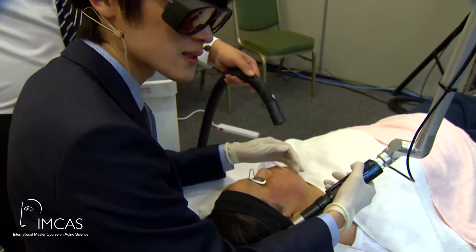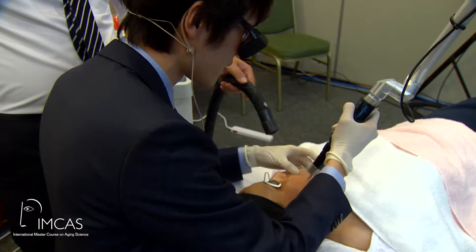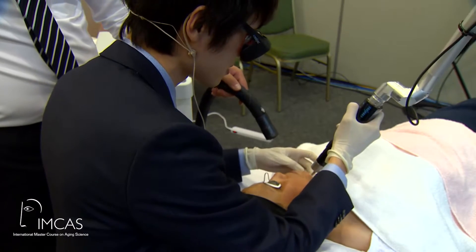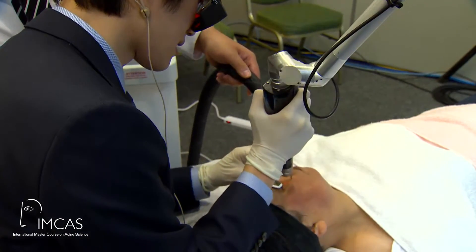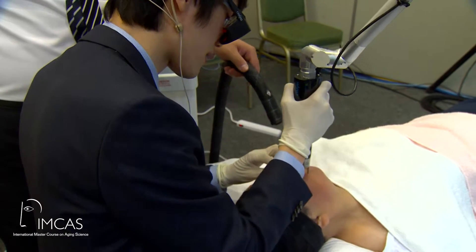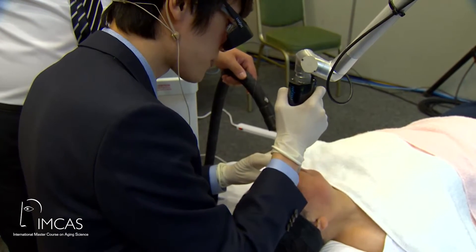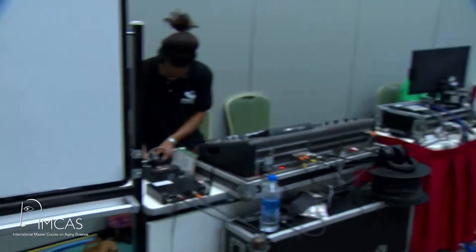For other areas — like near her marionette lines, under her eyes, or at the tail of the nasolabial fold where we usually see some fine wrinkles — it's fine to do more. You can go for four or six passes, and she would see improvement in wrinkles and pores along the malar area after only one treatment. For pigments, don't worry — even though we didn't cross those lesions, this is a fractionated delivery of energy, so the lentiginous will improve with tiny crusting that you cannot see grossly after two or three treatments.